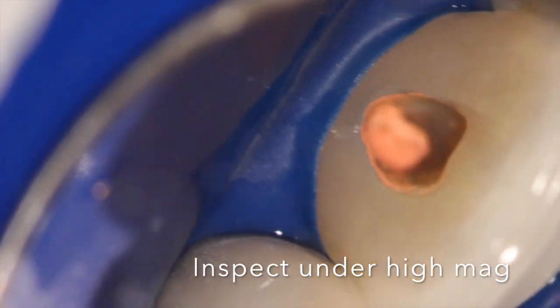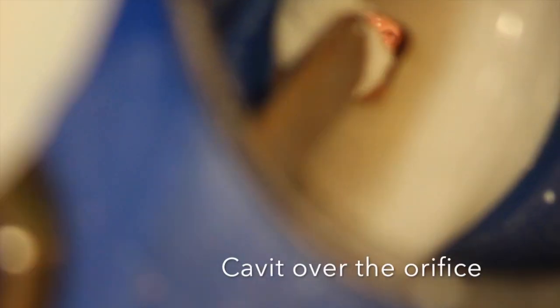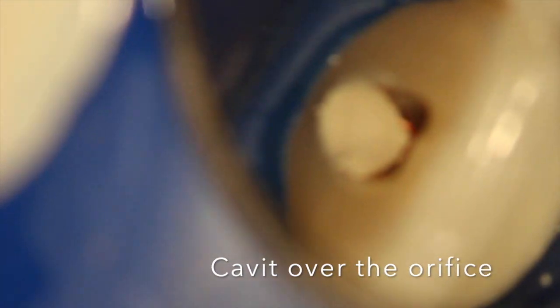Those old methods led to all kinds of side effects. Now we clean out the tooth carefully using long shank round slow-speed burrs, really inspecting the walls under high magnification. It's a nice advantage to have a microscope assisting us to do this better — an old technique, revised, and very useful today.